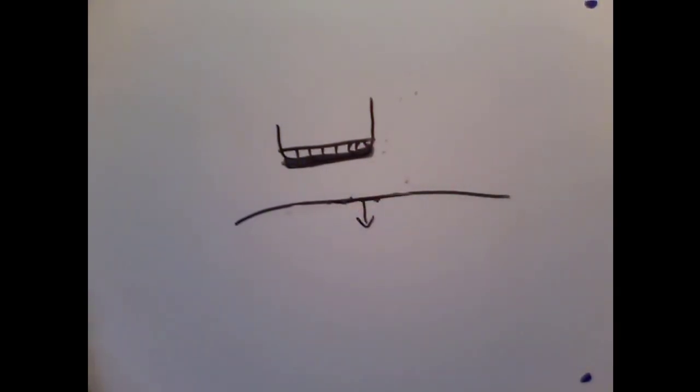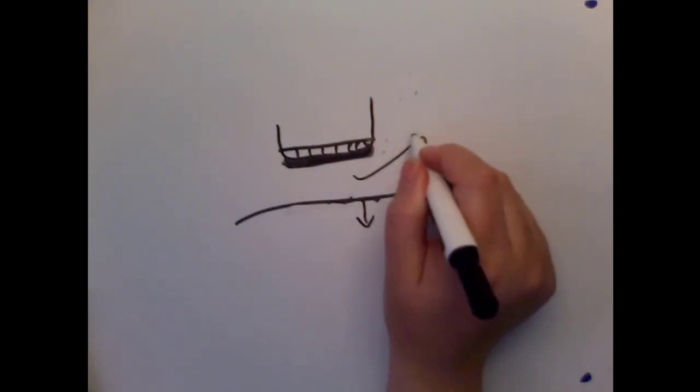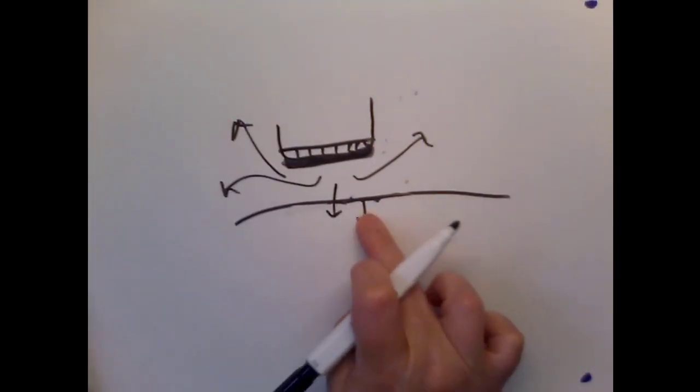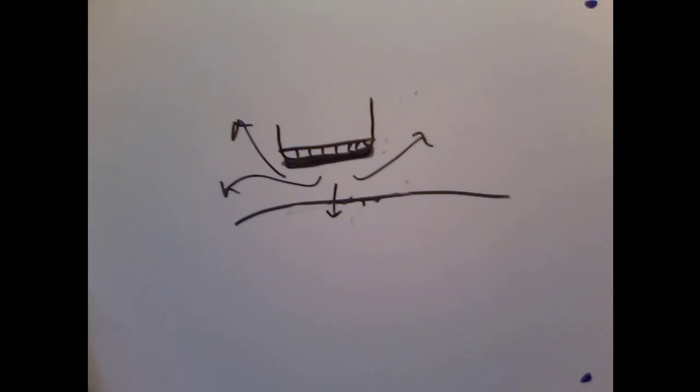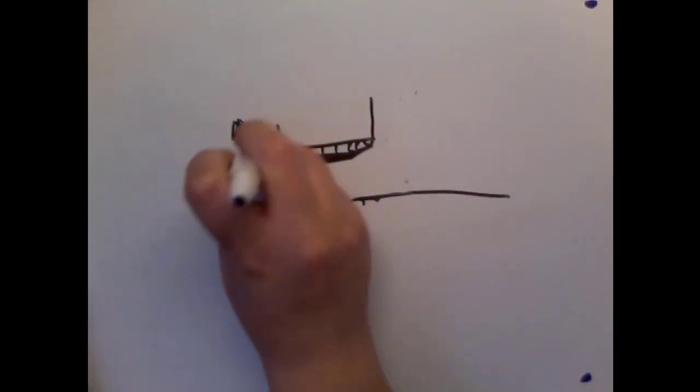We also know that air likes to scatter sound. So if the sound were to come out and just hit this air that's here, we're going to get sound going in all sorts of directions. Again, very little actually going into the skin. So we use our gel.